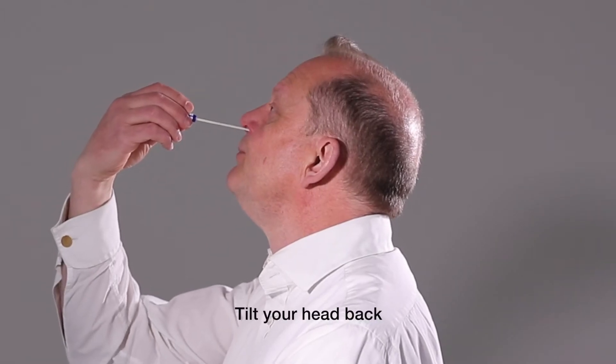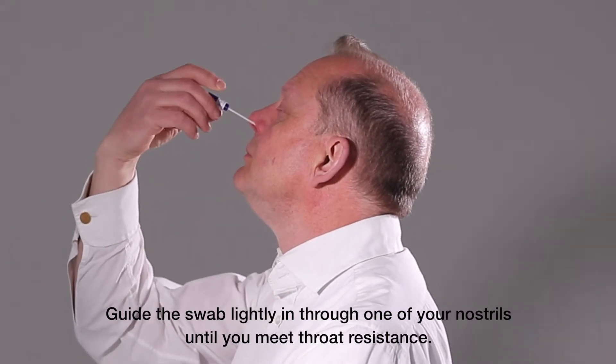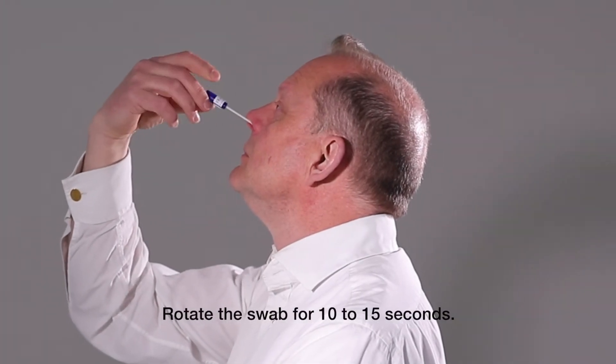Tilt your head back. Guide the swab lightly in through one of your nostrils until you meet throat resistance. Rotate the swab for 10-15 seconds.